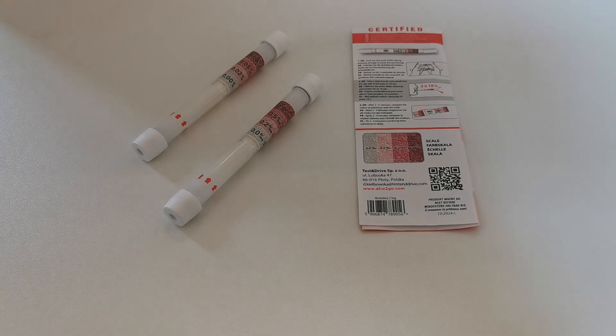Welcome to this UK Drug Testing and Valumed joint presentation. We're going to show you and demonstrate how to perform a single-use breath alcohol detector.